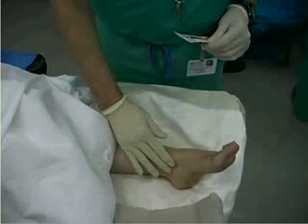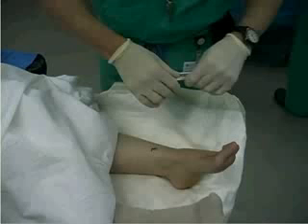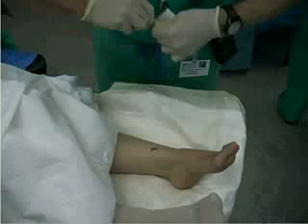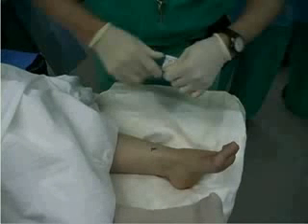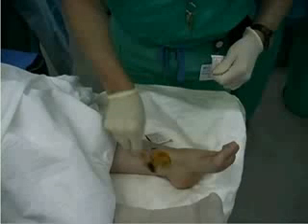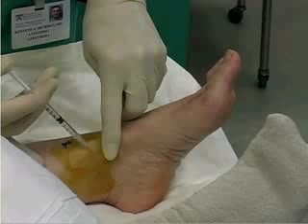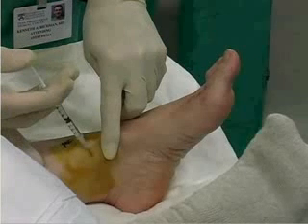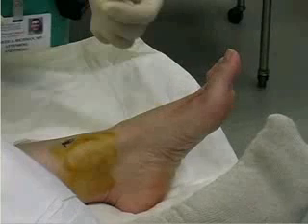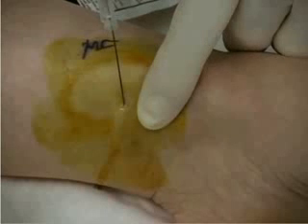If the block occurs at the level of the ankle, use the povidone iodine solution to cleanse the skin overlying the medial malleolus. Clean the area circumferentially. Allow the prep solution to dry. Using the 25-gauge needle, create a wheal in the cutaneous tissue over the medial malleolus with 1% lidocaine. Insert the 22-gauge needle through the skin wheal, directing the needle posteriorly toward the Achilles tendon.